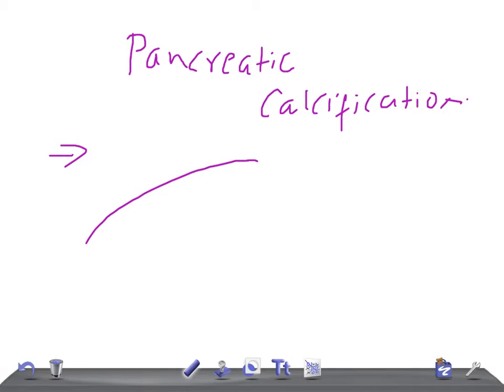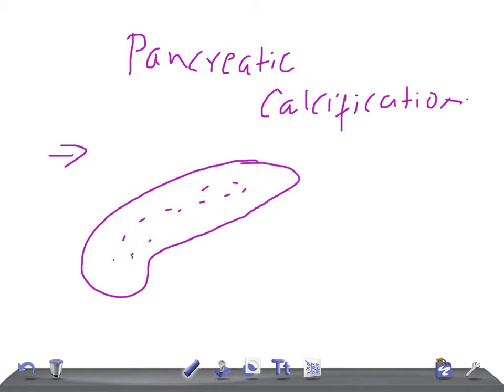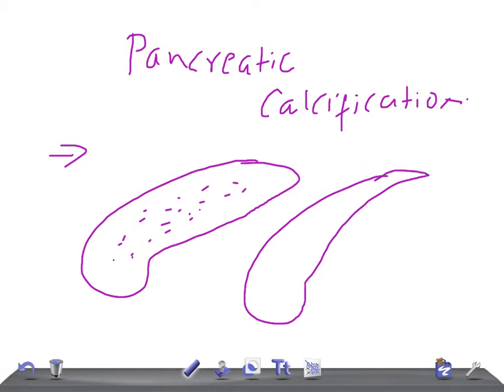Remember, there are different types of calcification depending on how it is deposited. In the pancreas, it can be deposited diffusely, or it can be very small, or it can be what we call spiculated, or localized to a specific area.